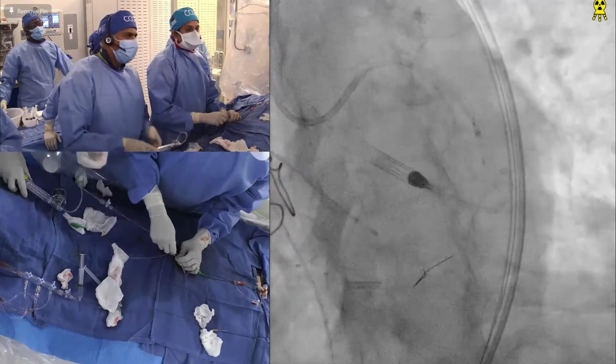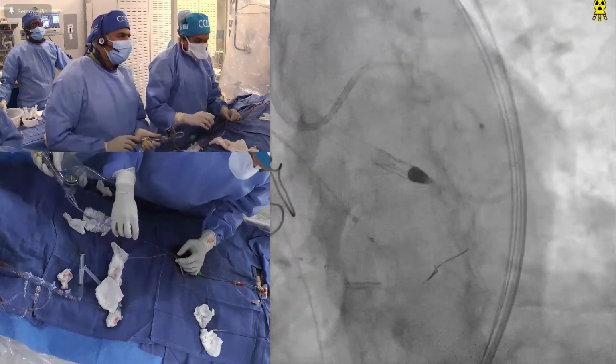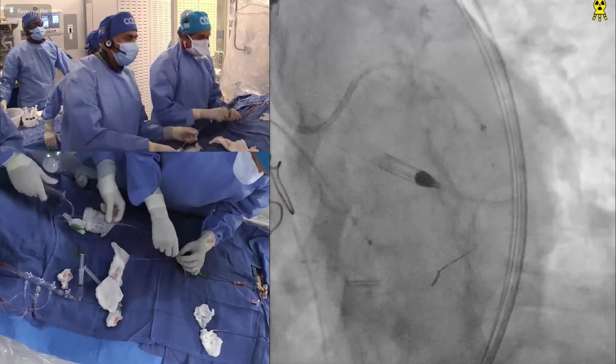Let's just do it while we're there. You can put it back in a second. Yeah, I think we did. Again, I don't know. It's in a good spot. Okay. We'll never get it. Okay, get the stent again.